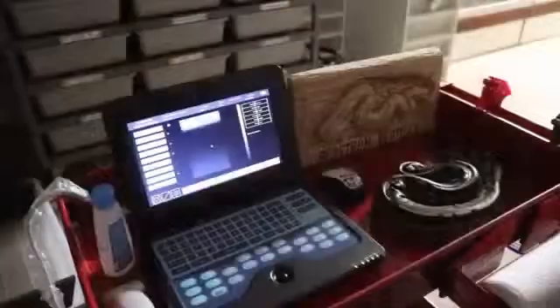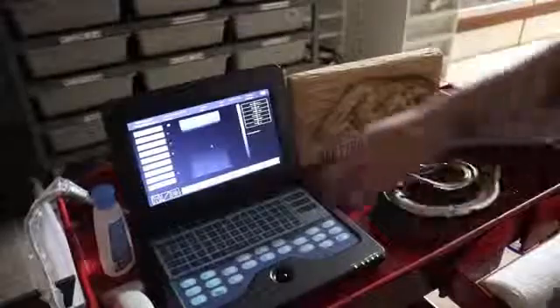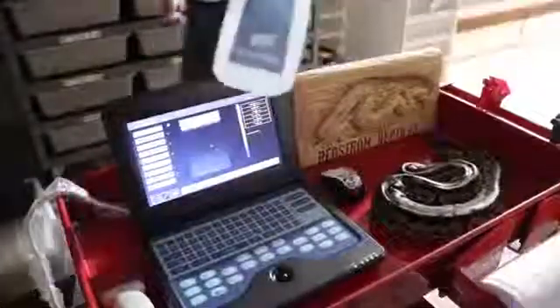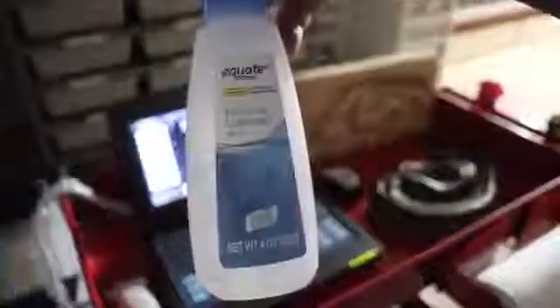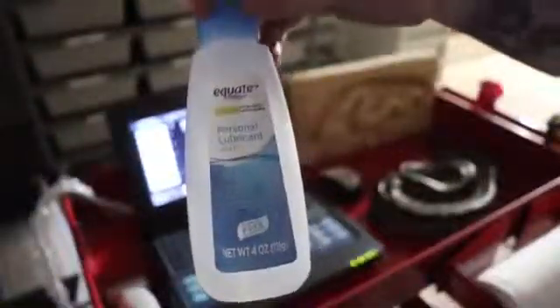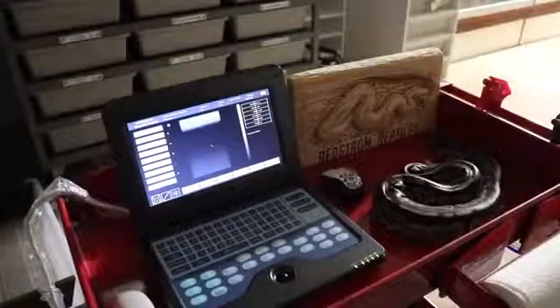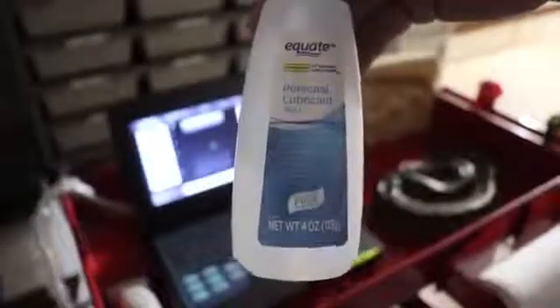It's wood, so it's very pretty. Alright, got this bad boy plugged in. I found that just straight old knockoff brand KY jelly actually works a lot better than the actual ultrasound gel that we have used before.